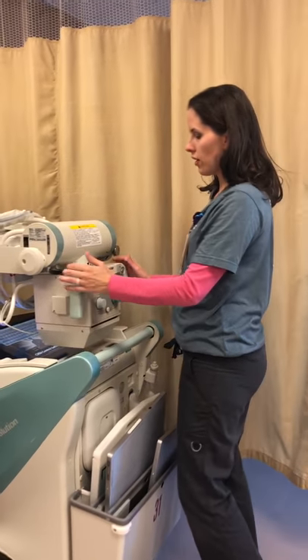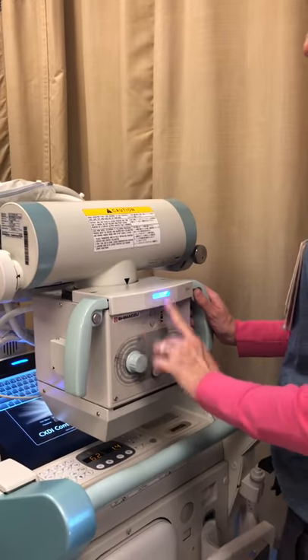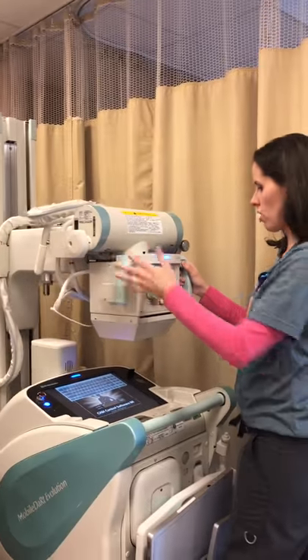To release the tube you have to push these buttons, and you heard it release and you saw this little blue light come on. So you know you're able to freely move the tower — the arm — itself.